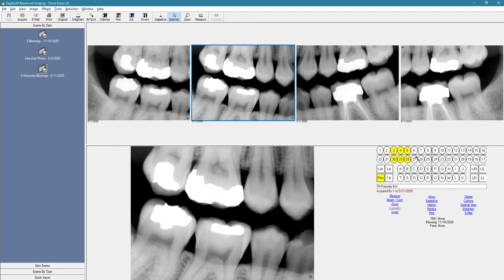If the patient were missing one of these, you can easily just uncheck the bubble, and that will remove that tooth from that image.